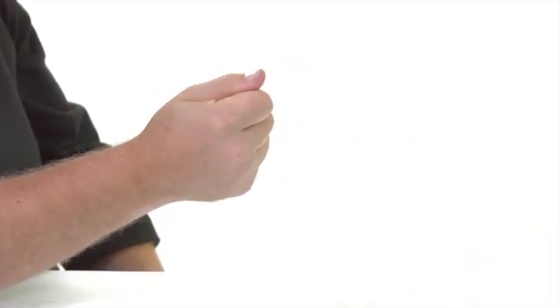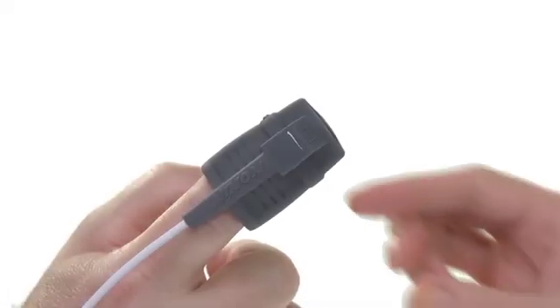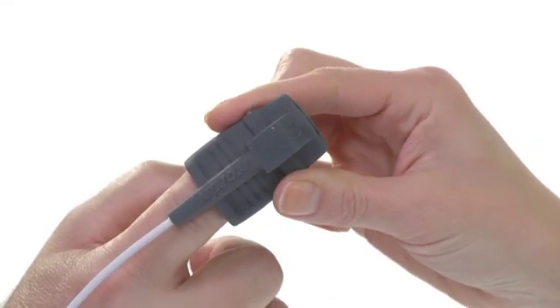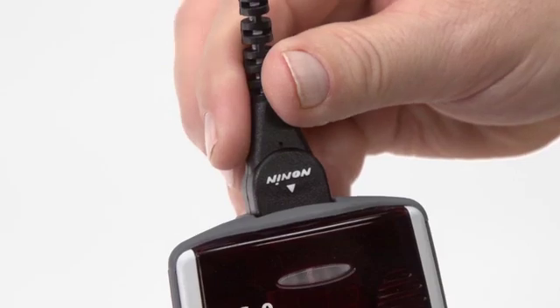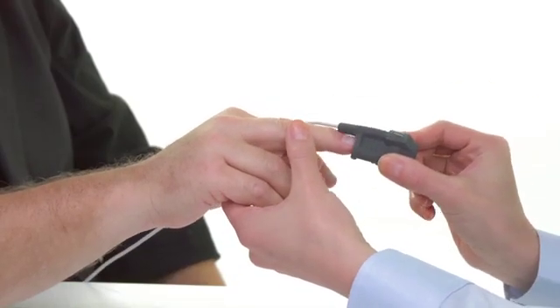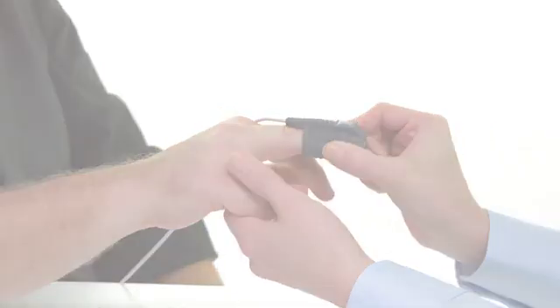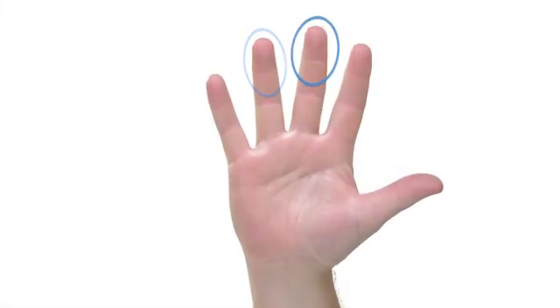Check the sensor position and connection every 6 to 8 hours or periodically per your institutional policy. It is easy to remove the sensor and reposition. You can rotate two different fingers for patient comfort.